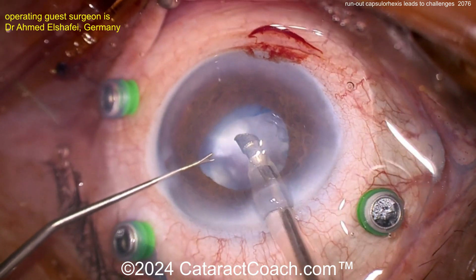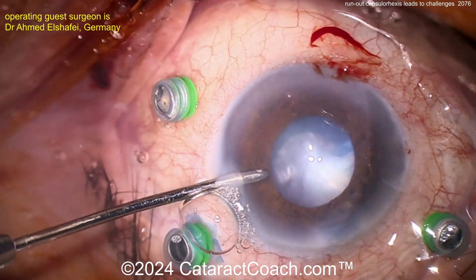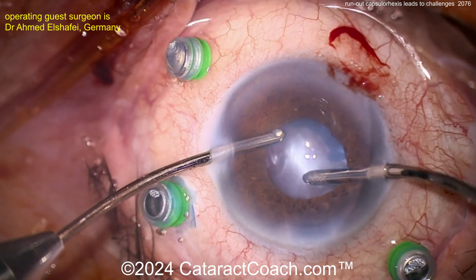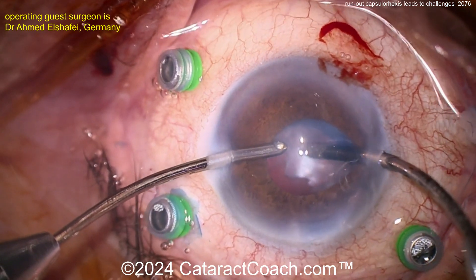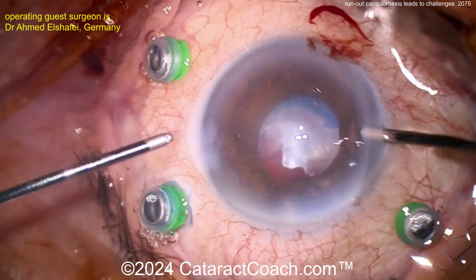Looks like some epinuclear material there. Now going in making a bimanual I/A setup here. I like using that infusion to kind of pull the iris aside to give yourself a little more view and see if you can aspirate some of that lens material. Kind of hard to get all of it.